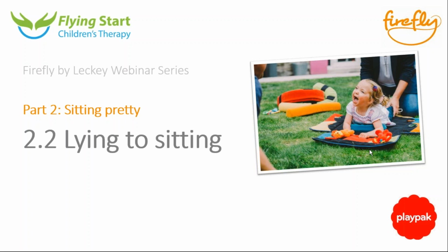Yep, so the bucking back is the high tone that we were talking about. It's really common and it's really hard to manage. I do feel for you. But this is something you can really speak to your therapist about. What I would often do in that situation, because I deal with a lot of these children, is I would probably give extra support at the top and on the shoulders so that he feels really well supported and really controlled.